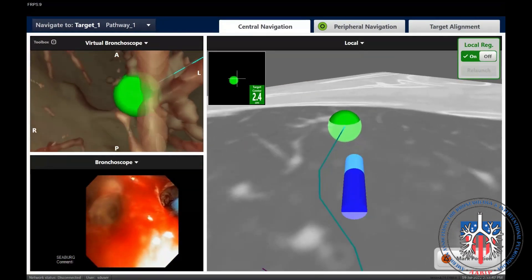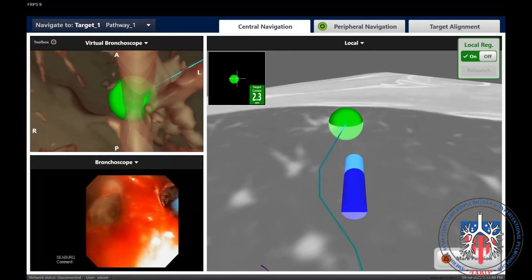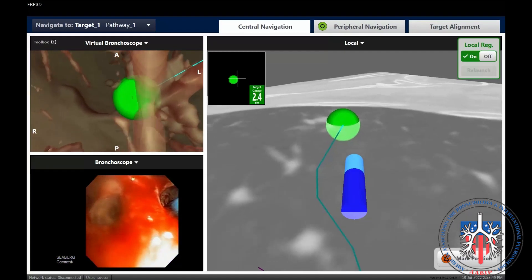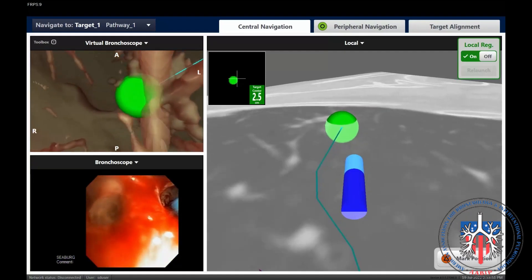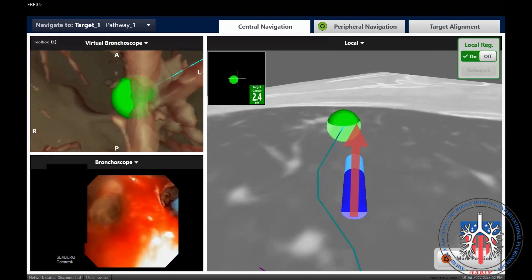You will notice a slight position change with removal of the locatable guide. In general, you wish the extended working channel to be positioned on the right edge of the nodule, as the stiffness of the biopsy tools will deviate the catheter slightly to the left.